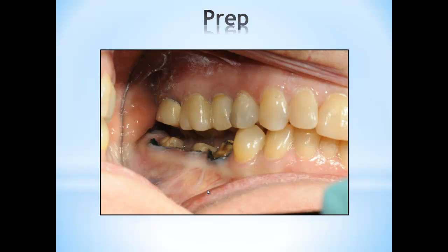What I was doing is checking my bite, to make sure it's right. Once again, you can see here the patient was numbed, and we're taking a buccal bite, and in the picture you can see the patient is not fully in occlusion. Sometimes that happens when we're taking a buccal bite scan and the patient is not fully biting. Another reason we sometimes have occlusal discrepancy, even in quadrant cases, is that there is no support in the back in this area. Sometimes the patient bites and squeezes against the opposing arch and produces red contacts in this area.